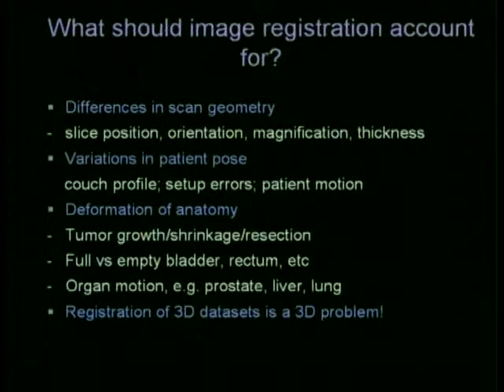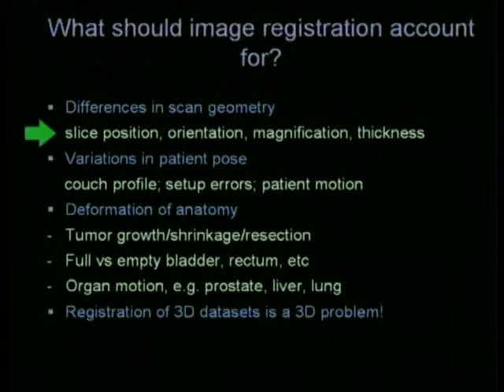Now what should an image registration account for? Difference in scan geometry. It should correct the slice position, it should correct the orientation, it should correct the magnification, it should correct the thickness.